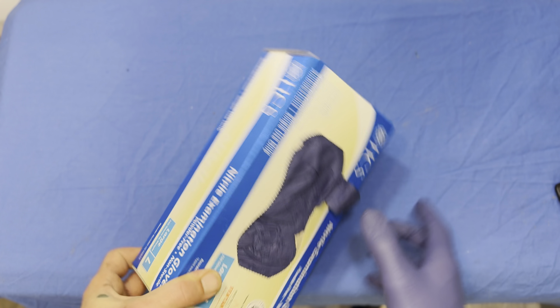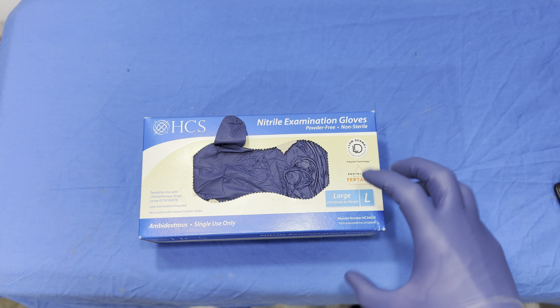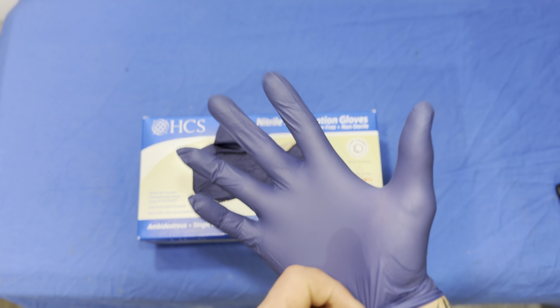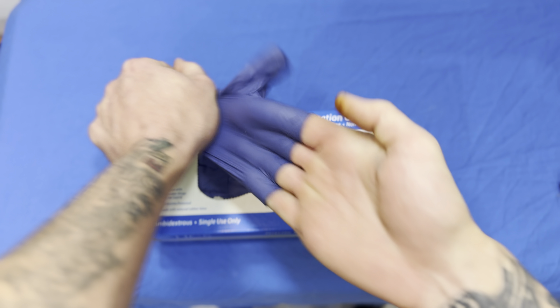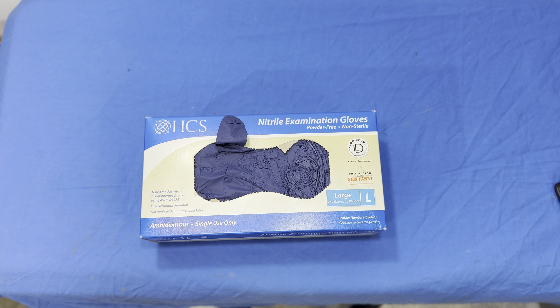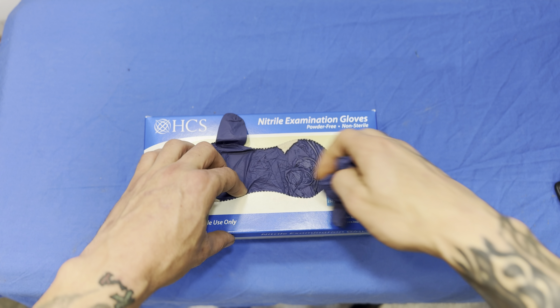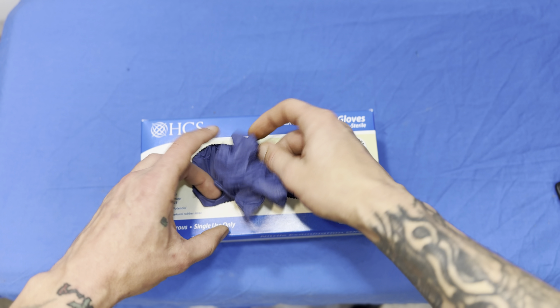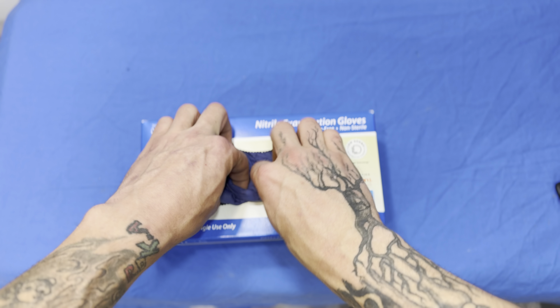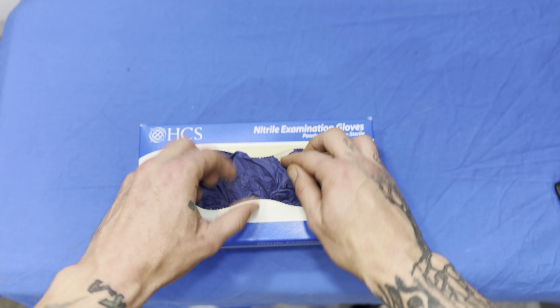They feel good. They're not super thick — I don't think they're quite as thick as the automotive ones — but I think they're a really good thickness. They feel strong enough, and they also feel thin enough that you can still feel what you're doing. The thicker the glove, the more protection, but also the less dexterity, so you don't lose a lot of dexterity with these.